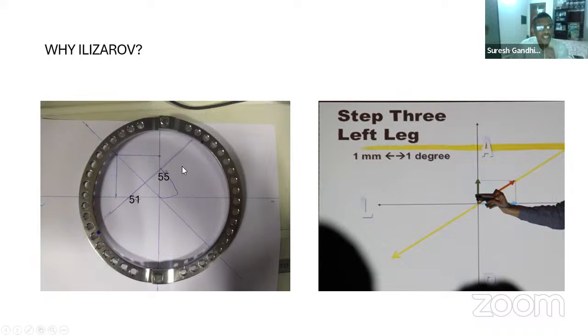Planning an oblique view may always be confusing, where to keep anterior, posterior, medial, lateral. I used to see it like this: if I wear a ring on the left side, this is a patient on the left side. So if I wear my ring on the left side, I plan it: this is anterior, posterior, and medial for my ring. How I wear a trouser, the same way I wear this ring. So I had to plan.